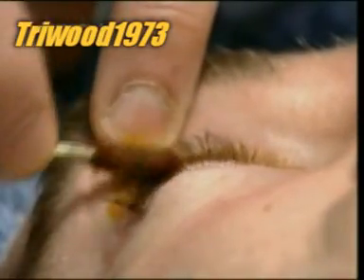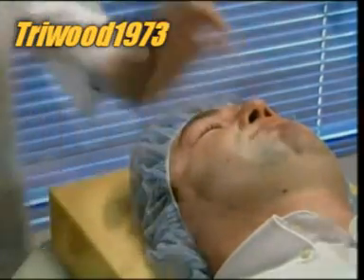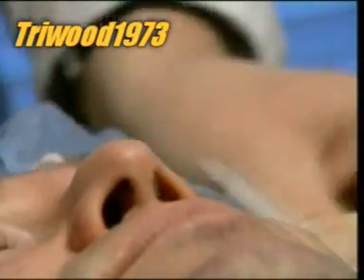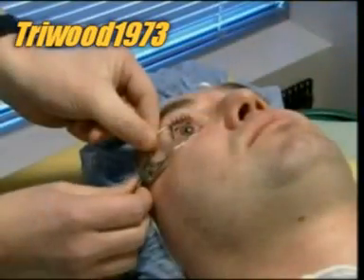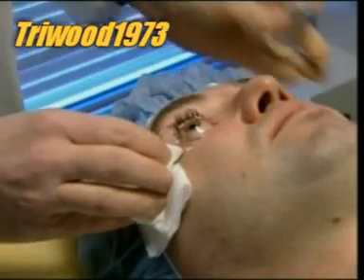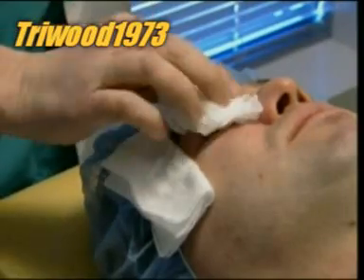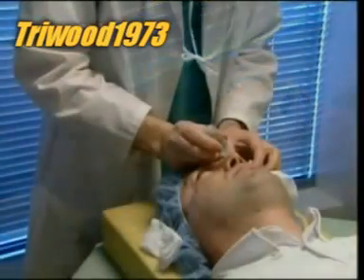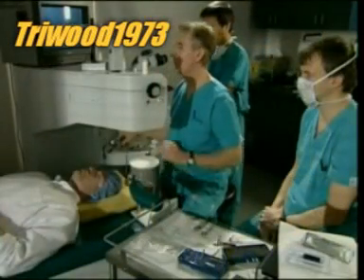The surgeon operates on the eye one at a time. He cleans the eye, the lid and the lashes with antiseptic, and administers anaesthetic drops to freeze the eyelid. He opens the lid wide with a speculum then rinses the eye with a saline solution. Everything's frozen so the patient doesn't feel a thing.